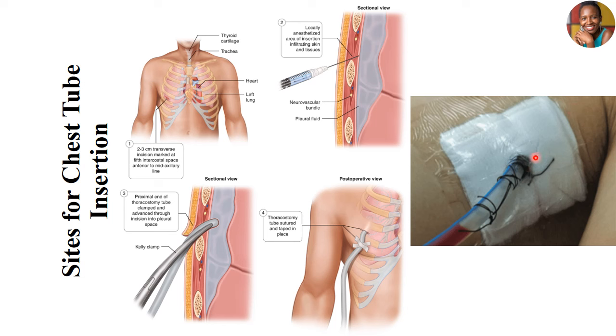So the role as a healthcare provider will be more so to check for any form of leakage, swelling and tenderness, infection around the site, and basically doing proper dressing using an aseptic technique.